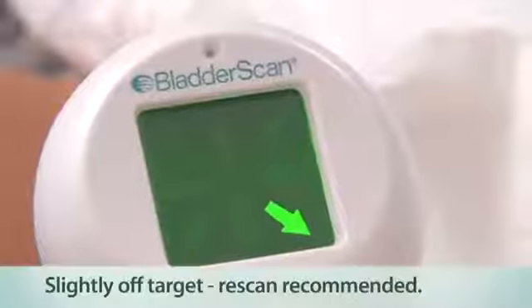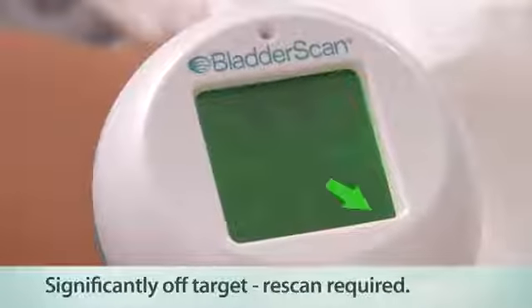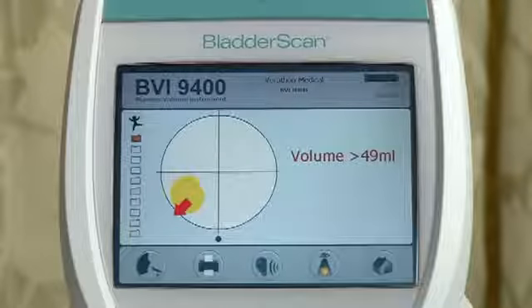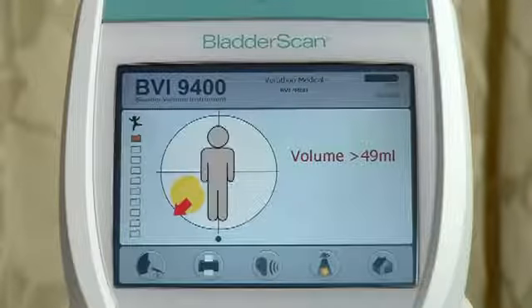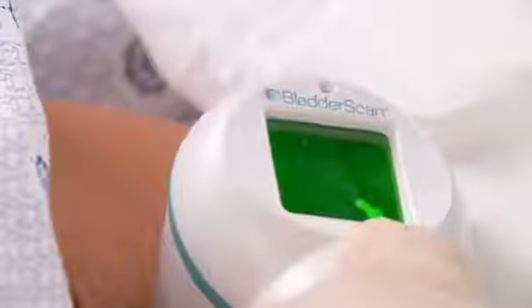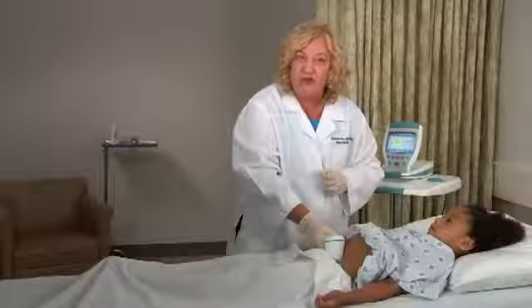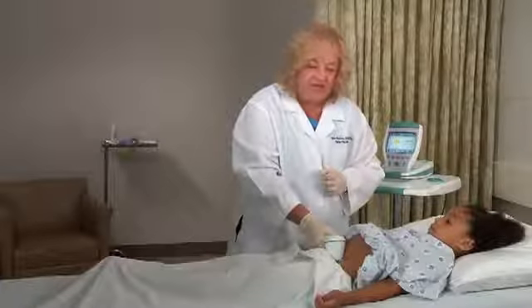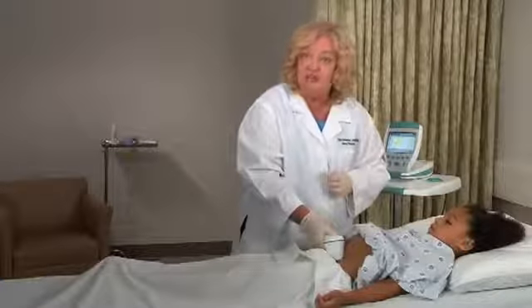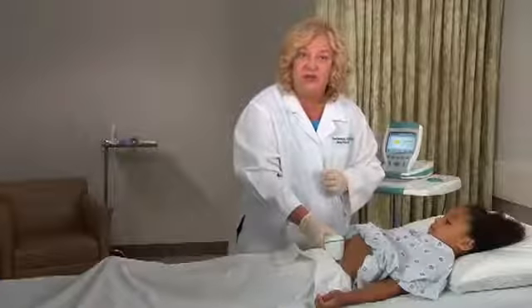A solid arrow means you are slightly off target. A flashing arrow means you are significantly off target. The console will confirm that the bladder is off target from the crosshairs, and an arrow will point in the direction of the bladder. Note that the 12 o'clock position on the console target coincides with the orientation of the patient's head. You may also see a screen that indicates the pubic bone is inside the ultrasound cone. If this occurs, you may want to re-aim and re-scan. Although the bladder may appear centered and the measurement could be complete, there is a possibility that the pubic bone is obscuring some of the bladder. By re-aiming, you can ensure you have captured the bladder fully inside the ultrasound cone.